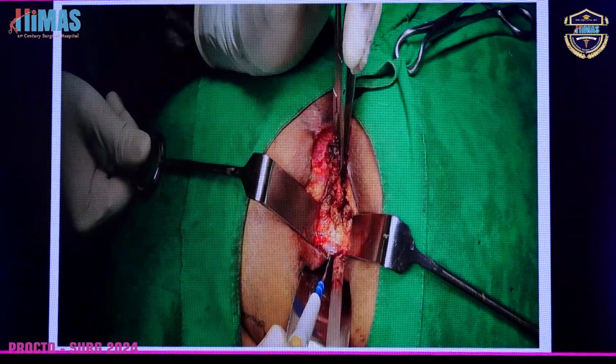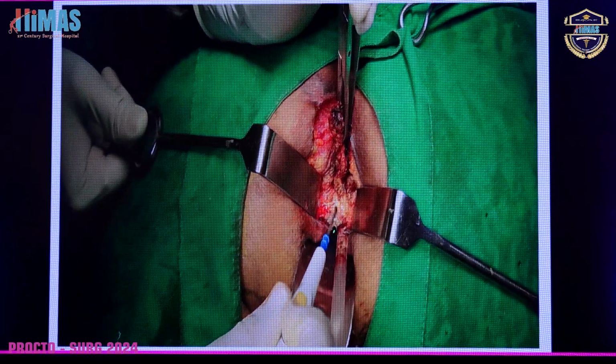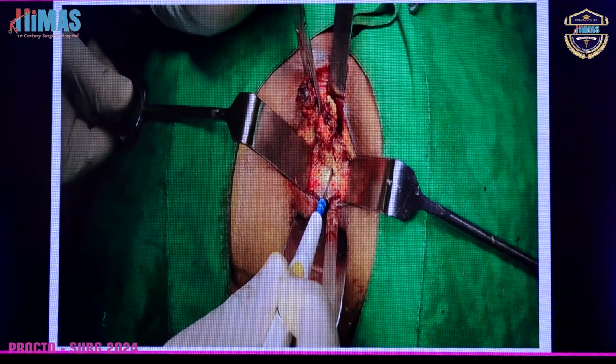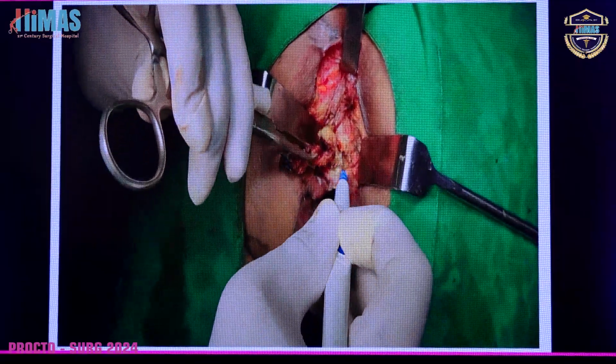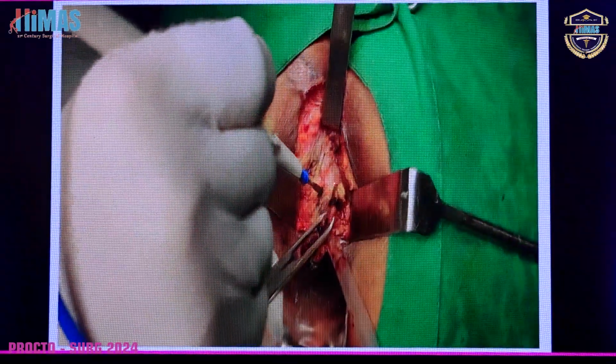So you can see, we have taken the incision till here, and then it is a high transsphincteric tract. We have taken out this opening from inside, and this is again the supralevator portion going inside. So we prefer taking the whole tract and the whole disease outside, because since it is already a recurrent fistula, we don't want any recurrence again. And you can see this is the branch which is going in the supralevator portion.